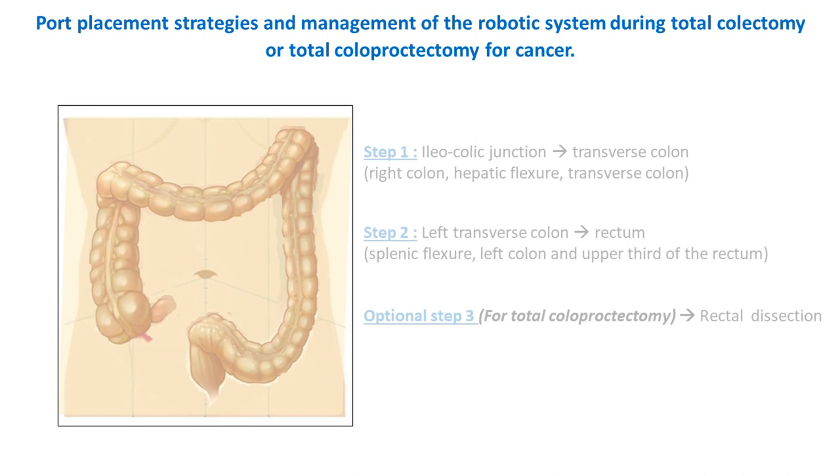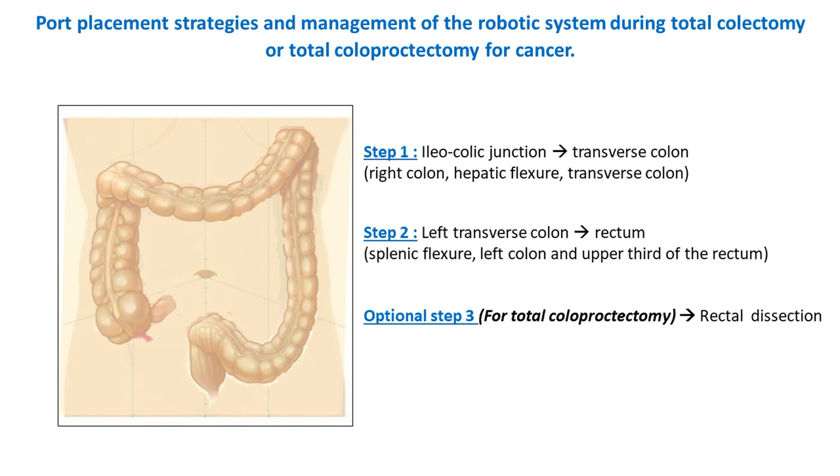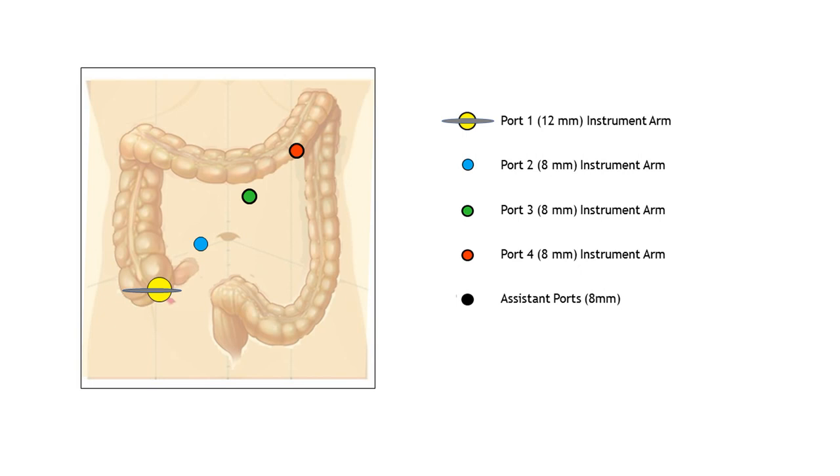Our approach for robotic total colectomy uses the same ports for the dissection of the right and the left part of the colon with two main dockings. Surgery is planned clockwise from the right to the left without moving the patient cart. Four robotic ports are positioned on an oblique line across the umbilicus from the right iliac fossa to the left hypochondriac region. All of them are 8mm ports except for a 12mm port for the robotic stapler, inserted in the right iliac fossa at the future site of specimen extraction incision.